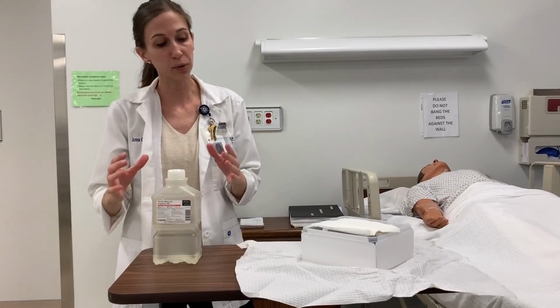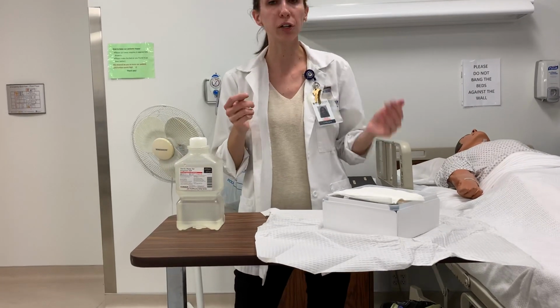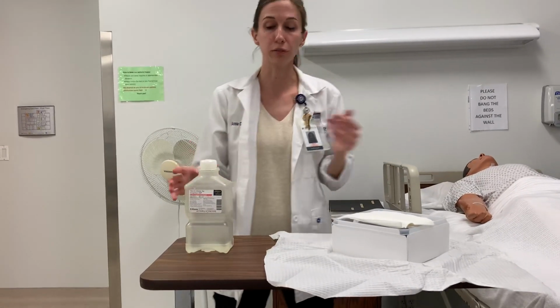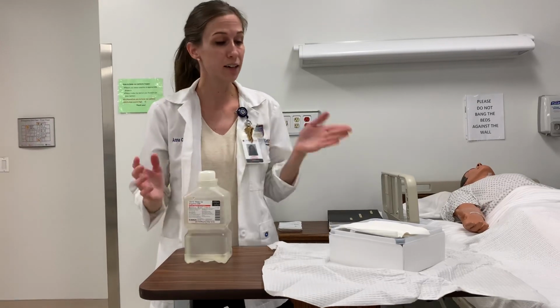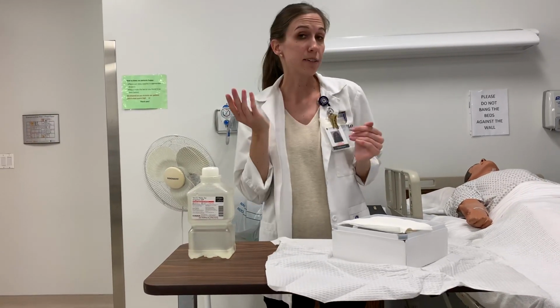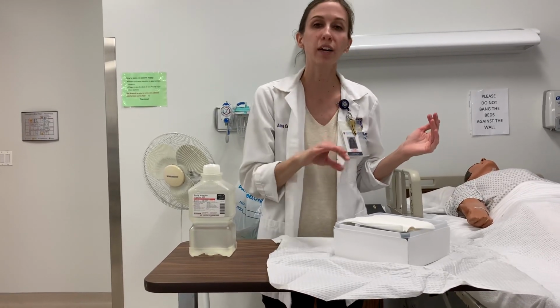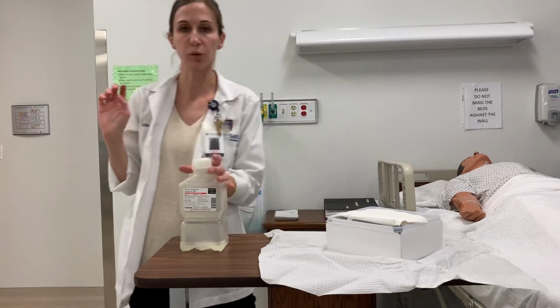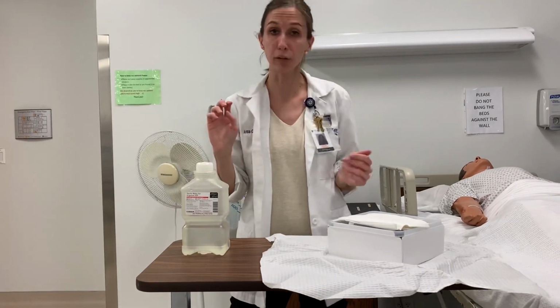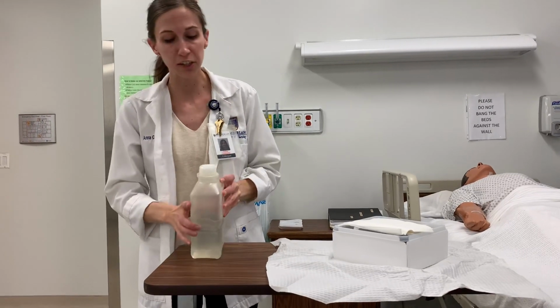If I was working with this, sometimes you have kits that you can open where you need to pour is already exposed to you, so you could work with two hands and pour. Other times you have to don one sterile glove and keep your other hand not gloved yet, so that you can move items off to the side and then work with your non-dominant hand to pour whatever you needed. So if I were to open this again, I check that it's not expired.